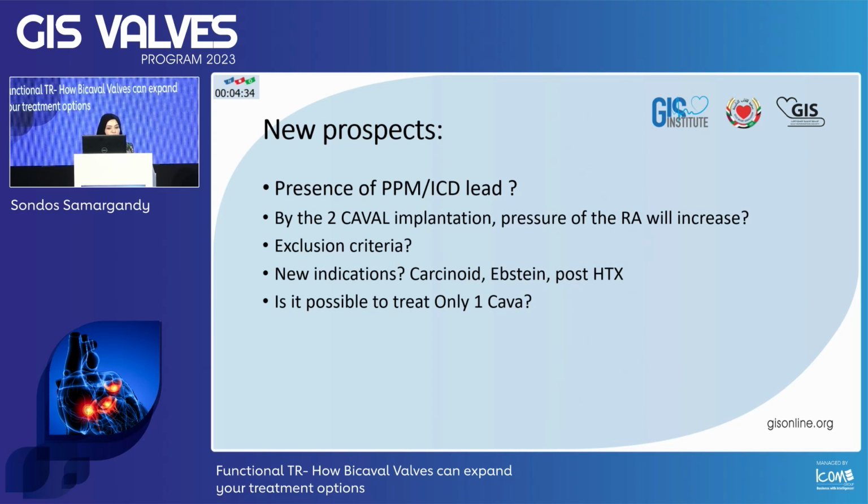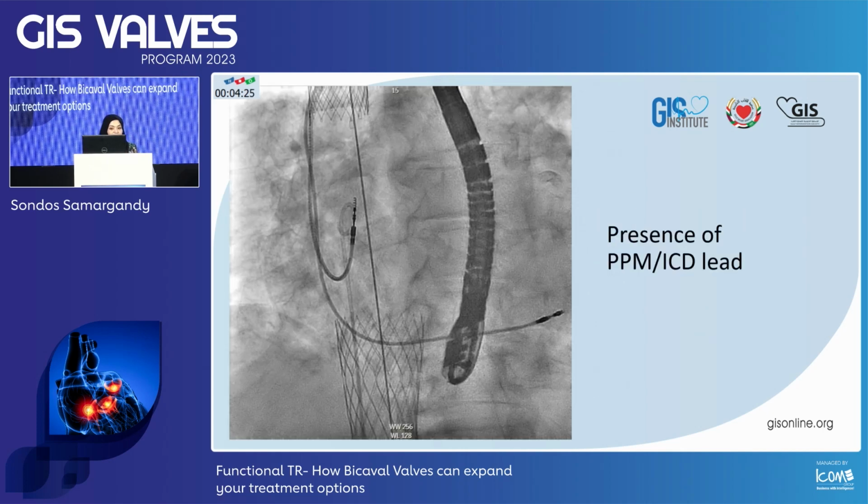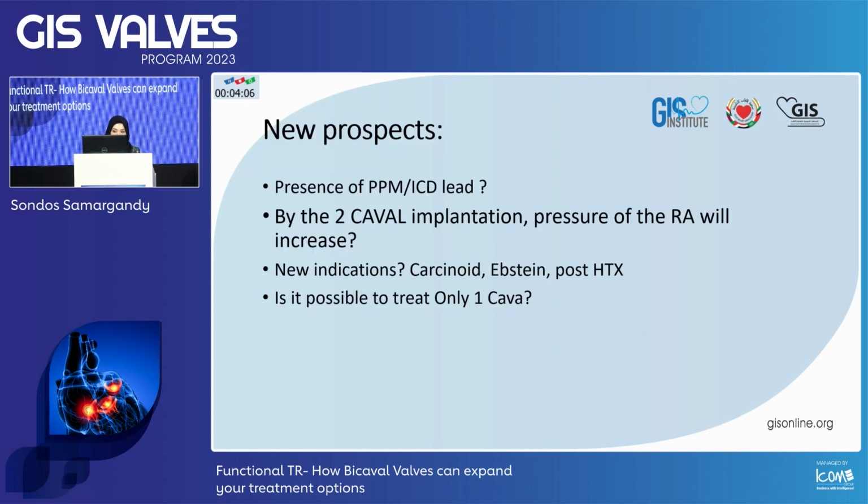Will the presence of a permanent pacemaker or an ICD, because this is the Achilles heel in edge-to-edge repair, affect image quality when you go for a repair? Well, can you do it? Yes, the answer is yes. This is one of the earliest patients we did. This patient in particular was admitted every 4 to 6 weeks for ascites. This happened 4 months ago. Since then, zero admissions. I saw her last Sunday. She's been doing great, she's becoming more functional, and her weight has reduced also.